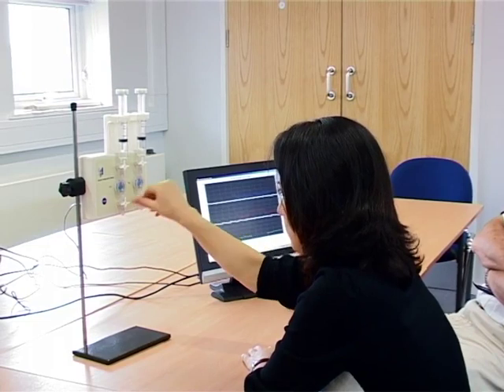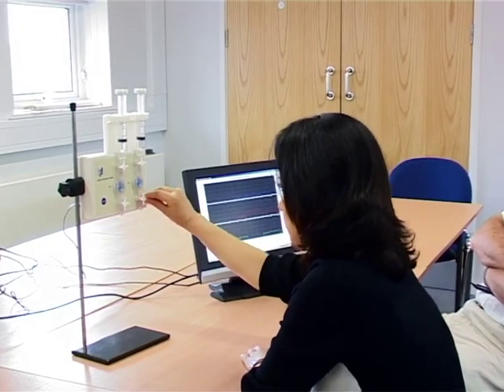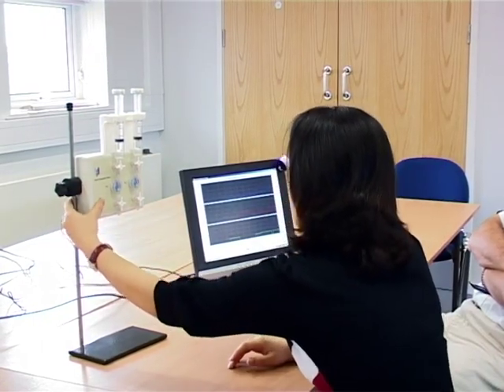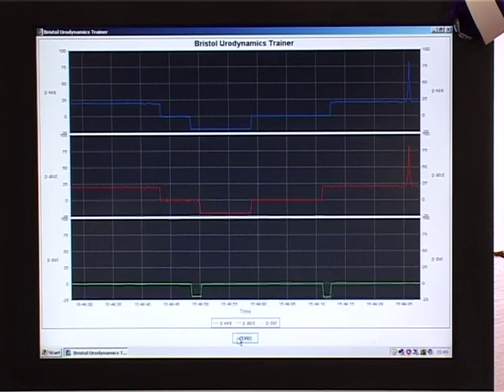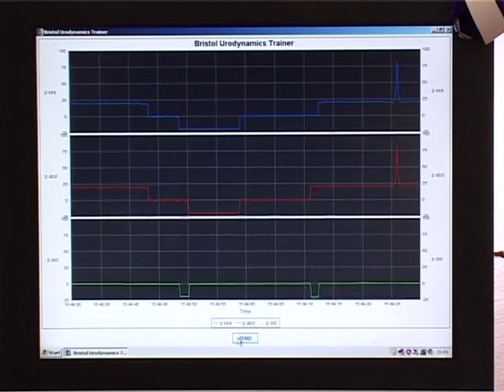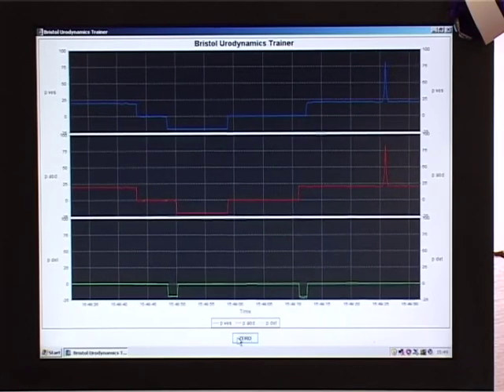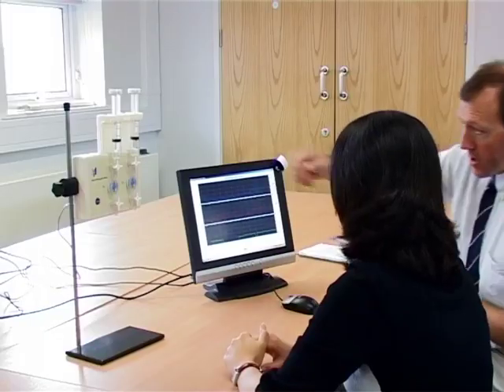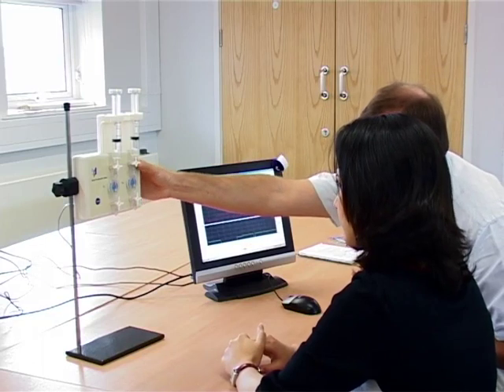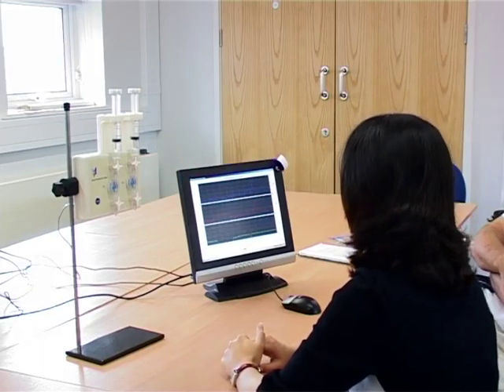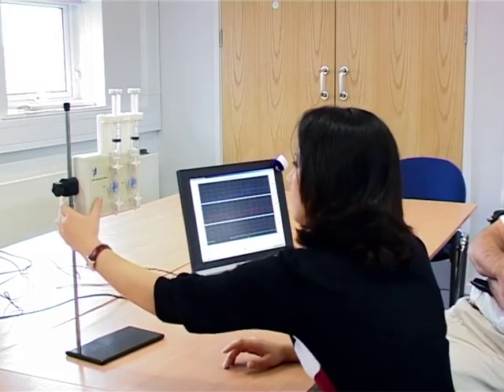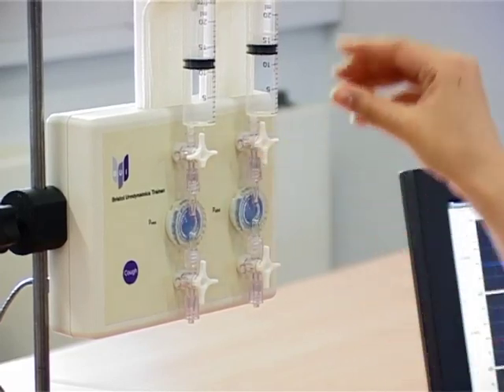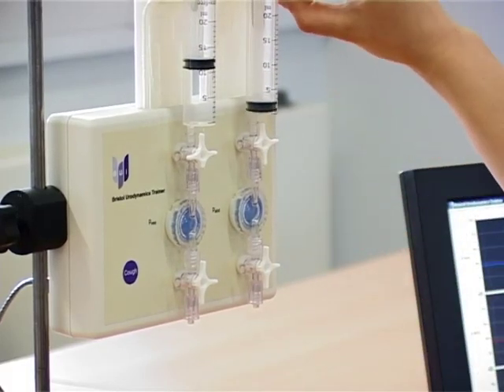The trainer can introduce simulated problems that the trainee has to resolve. In this case, the trainee is setting the system to zero to atmosphere, opening to patient pressure, and checking a cough. The trainer now introduces a simulated air bubble that requires flushing out. The trainee identifies this by doing a cough and then resolving the problem by flushing the air bubble through.